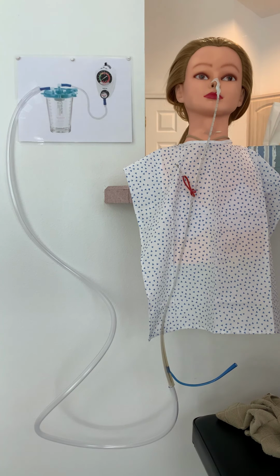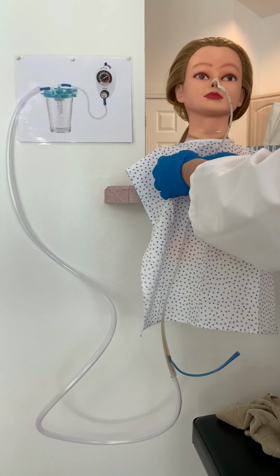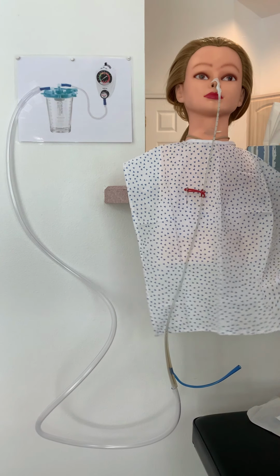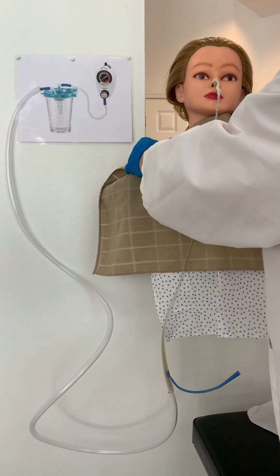I'm going to go ahead and put my gloves on. If I can get them on. Okay. I'm going to go ahead and unpin the safety pin on the tube so that I can put a towel or a waterproof pad across your chest there. Okay.